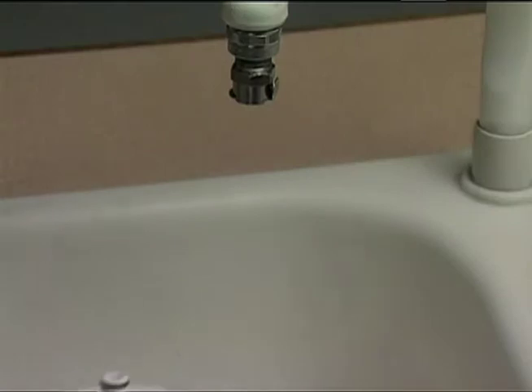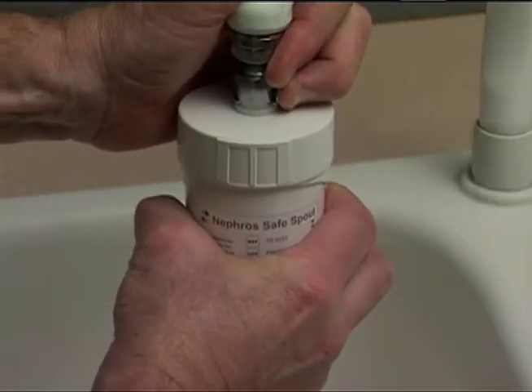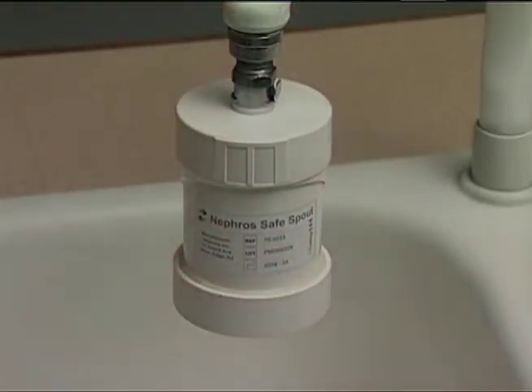Insert the filter inlet, male quick connect with black o-ring, into the female quick connector. Make sure the latch on the quick connector locks the filter in place.